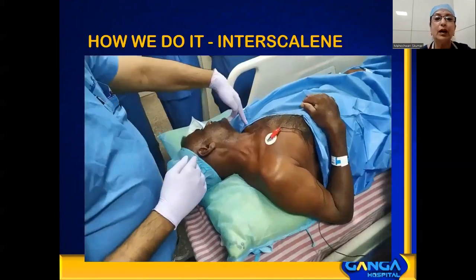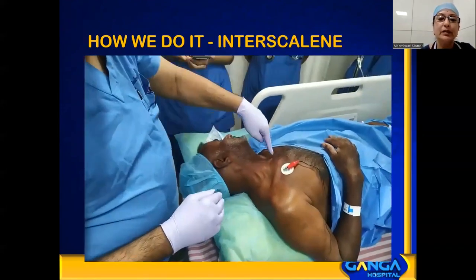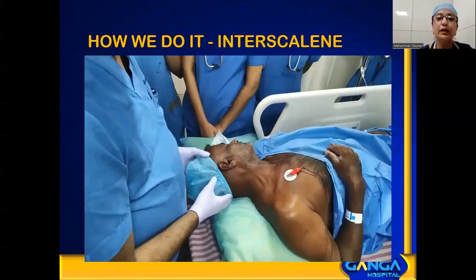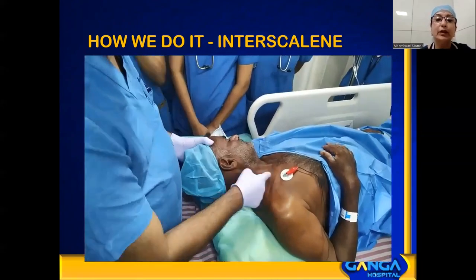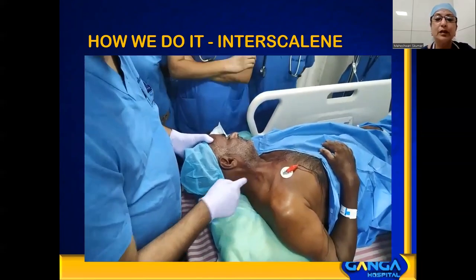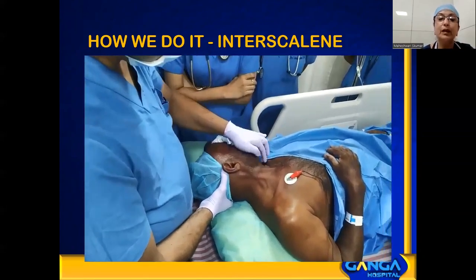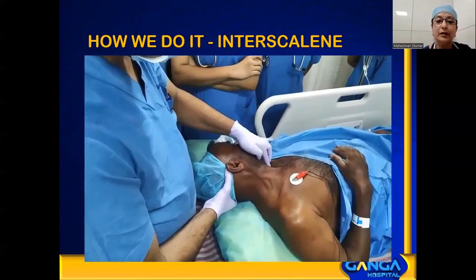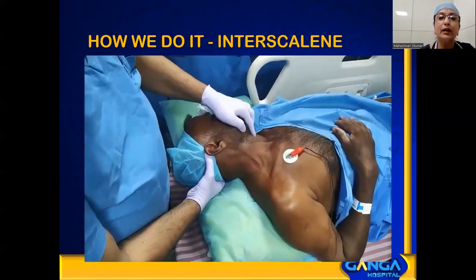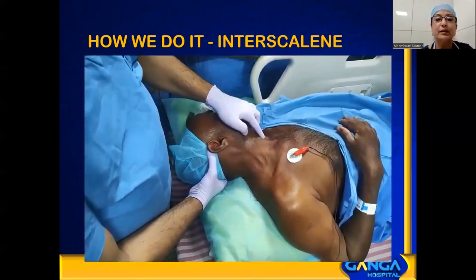In this video, I will tell you how we do the interscalene block. Turn the patient's head to the opposite side of which we are going to give the block. And if you see, he has a very good anatomy. You raise the head of the patient and make the sternocleidomastoid muscle very prominent. You can see the sternal head and the clavicular head. Now palpate the center of his neck. First we palpate the thyroid, and then below that, we palpate the cricoid at C6.